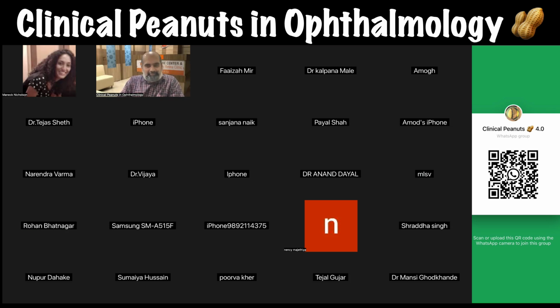The Alcon lens, if I'm not mistaken, has a yellow tinge in it, and the Technis lens is white. From what we normally use, even when it's non-toric, we don't mix, because the two most common companies we use are J&J and Alcon. In general, the Alcon lenses have a little bit of yellow tinge you'll see when you take it out of the eye, because they are blue blocking. J&J doesn't believe in that. They believe that it's not needed. So I would not mix and match just because of that one thing. Plus, if you've got a predictable reading with one, I would more likely put the same lens in the other eye.